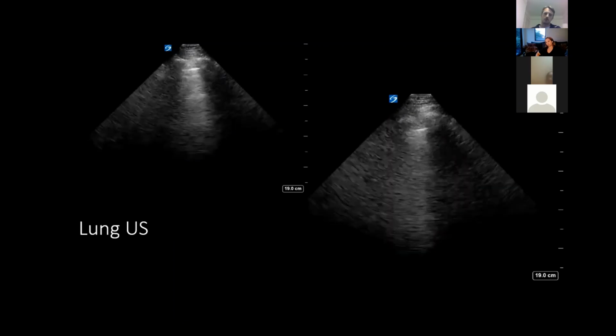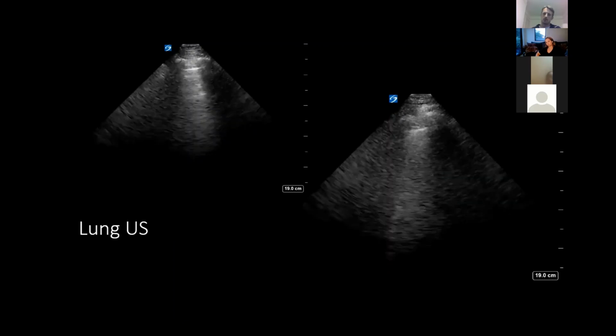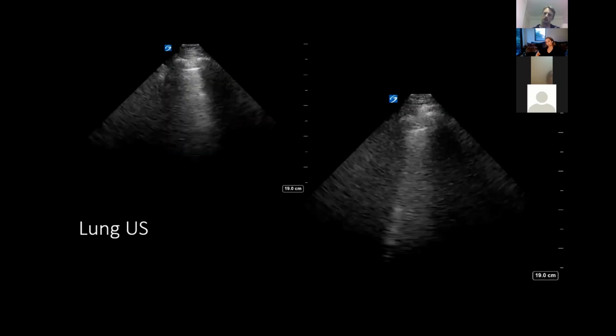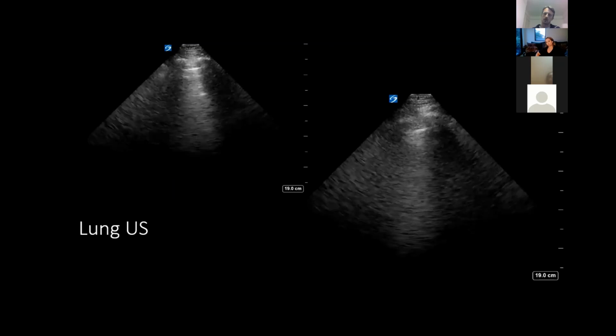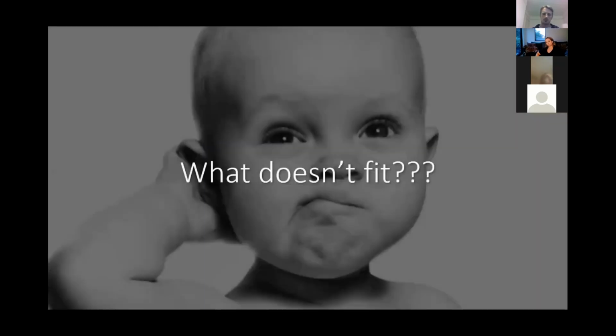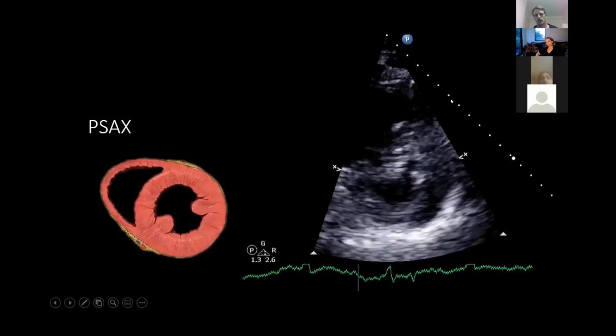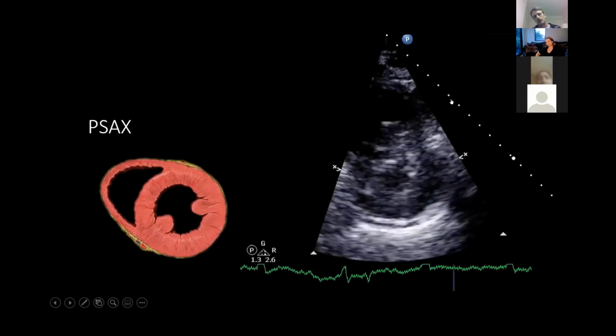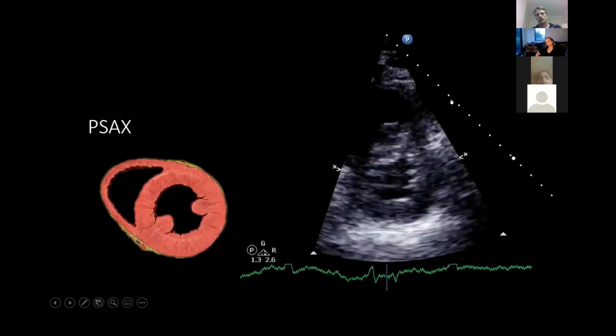So we were questioning, why is it that this woman is quite so hypoxic? And people saying, oh, she's having a STEMI, she's consuming lots of oxygen. I said, no, that's not quite how it works. So what do we do next? So we have another quick look whilst they're talking to the cardio center. And this isn't her echo, unfortunately I didn't record it, but I wonder if anyone can see anything on here that they think is unusual.